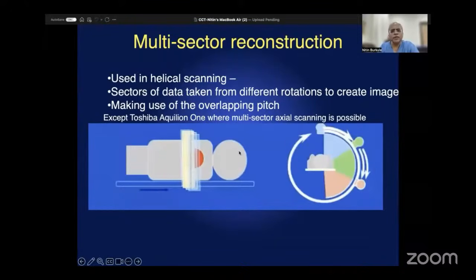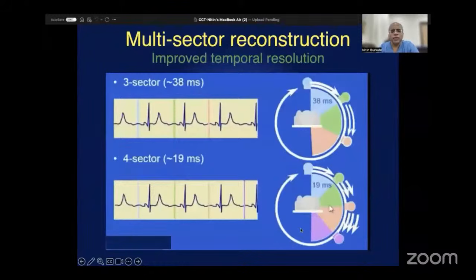So obviously in this, you will need multiple cardiac cycles with a very, very stable rhythm, because you have to catch the phase exactly at that moment. Theoretically, it looks very attractive. However, you should have a really stable RR interval because you have to catch that exact phase.